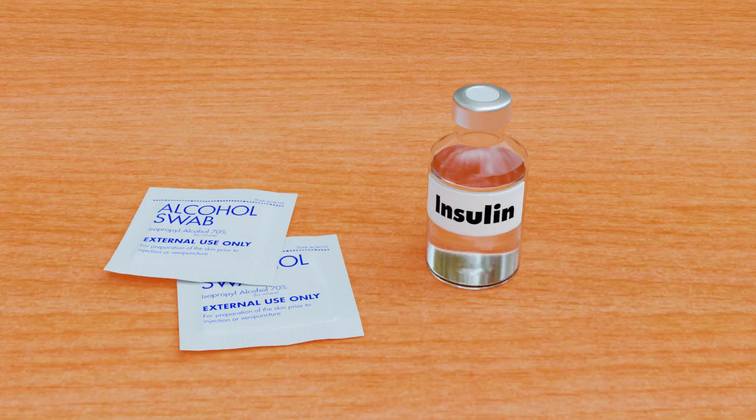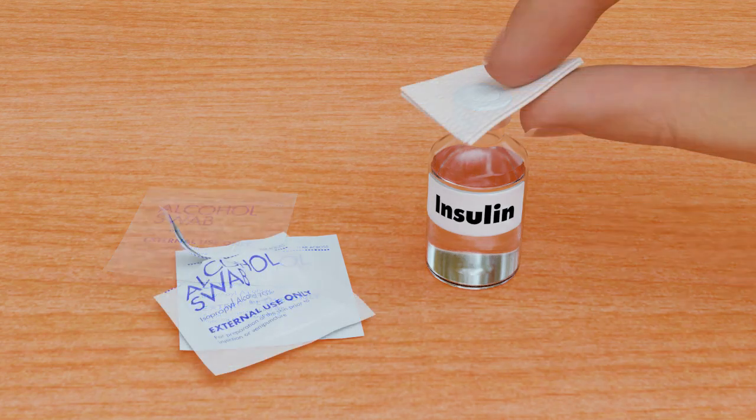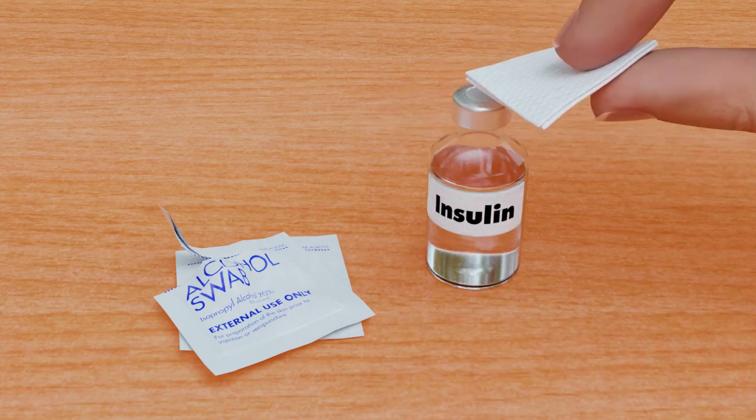To reduce the risk of air bubbles, make sure the insulin vial is at room temperature. Wipe the top of the insulin vial with alcohol and wait until it dries.